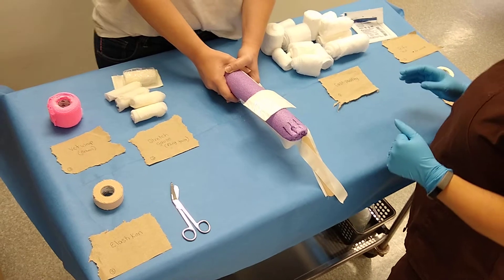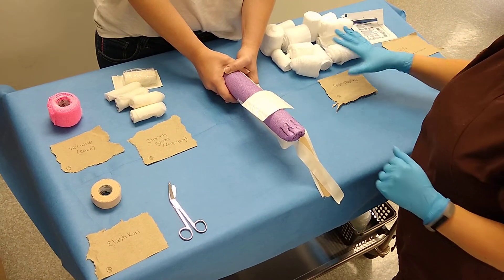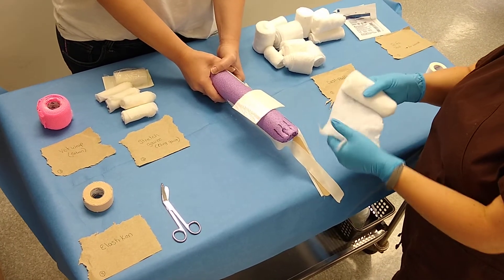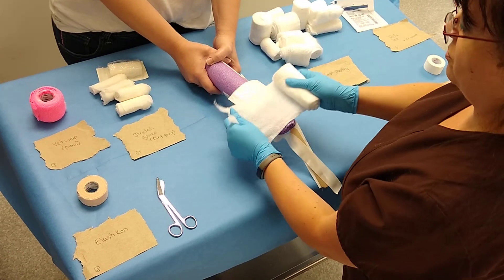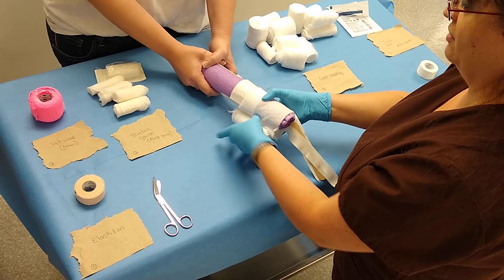The next step is to apply all the cast padding. We have an assortment here. Typically you're going to have the same size to use, but technically it doesn't really matter. Start by unrolling, leaving your toes exposed around the dog's foot.